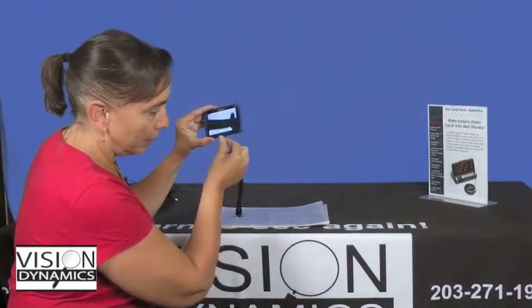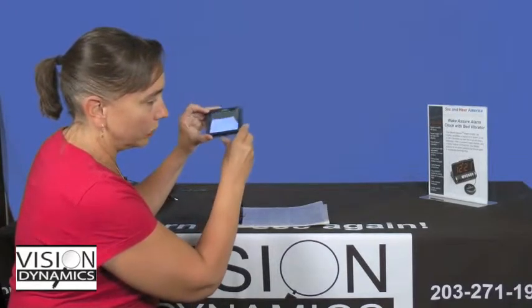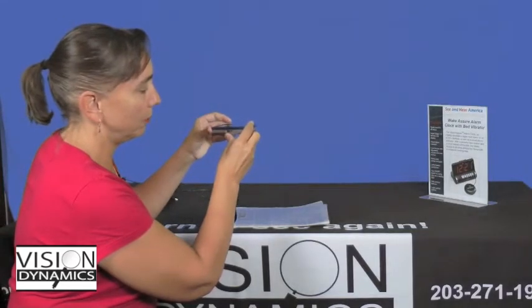And then along the bottom of your Mini is the toggle switch that changes the size of your magnification. Remember, you purchased it because it has a great 5, 7, and 10 level of magnification, 3 levels of magnification. Not to mention, you can always pull it away a little bit from the paper if you need a little bit more. Rocking that switch right and left changes your levels of magnification.